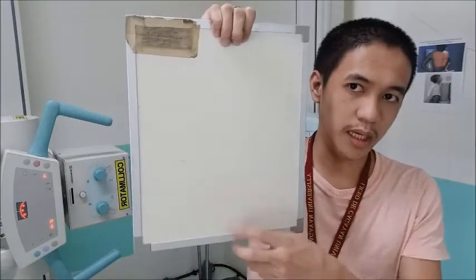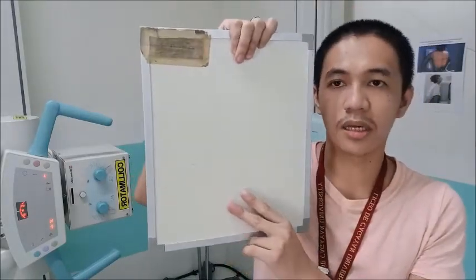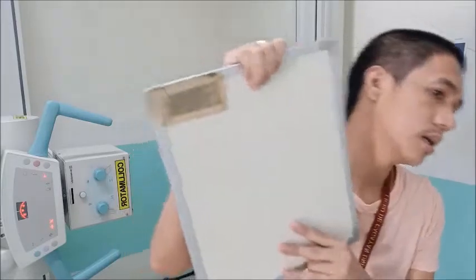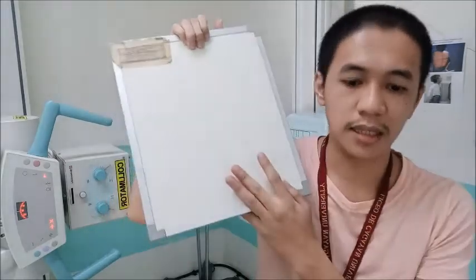You can do the PA using a 10 by 12 and the lateral using an 8 by 10 cassette. And if the patient is tall, you can use the 11 by 14 for the PA and also 10 by 12 for the lateral.